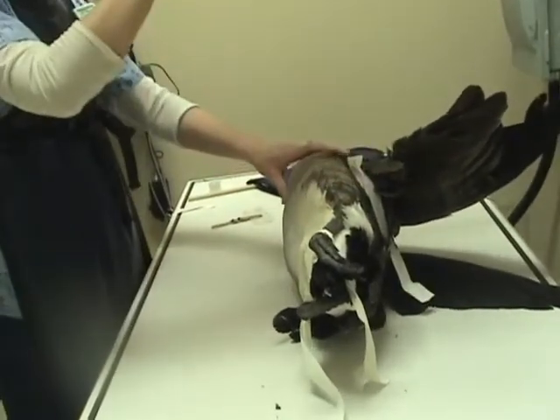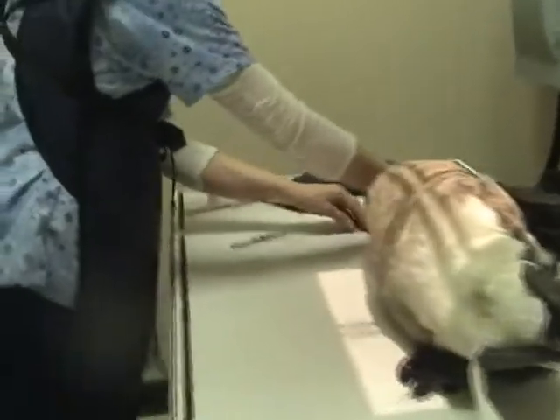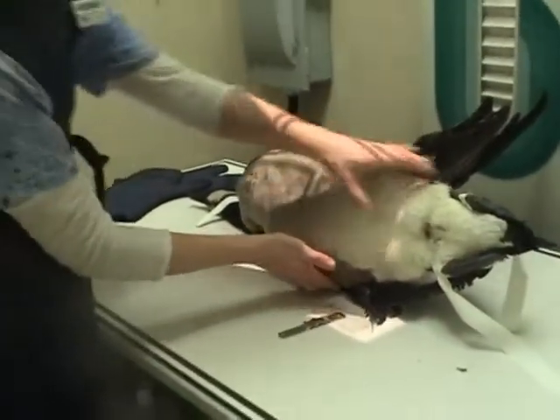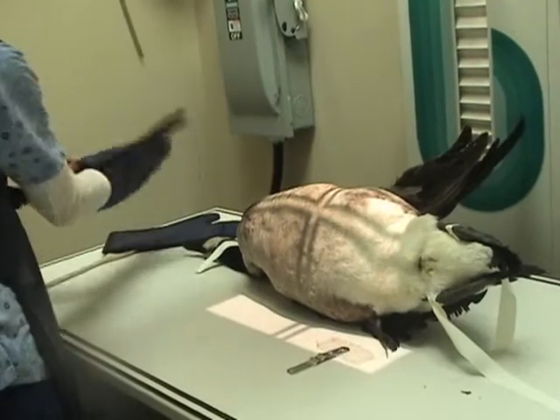You want to make sure that you have the beam center placed over the middle of the body between the spine and the sternum. You also want to make sure that you have the correct marker placed in there, and you also want to make sure you have some tape over the jaw of the bird.